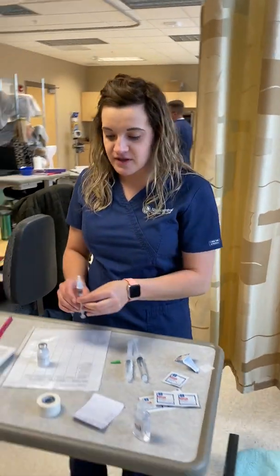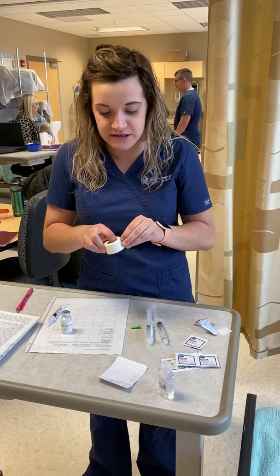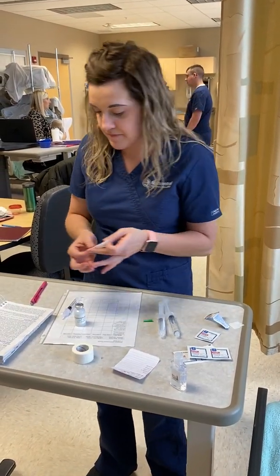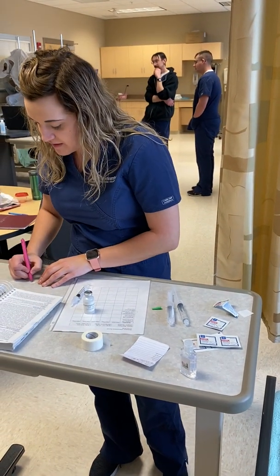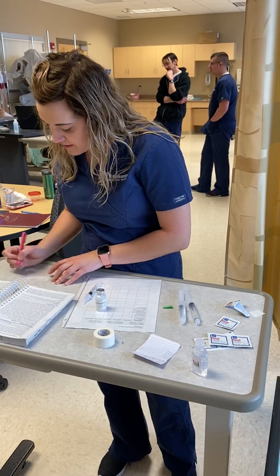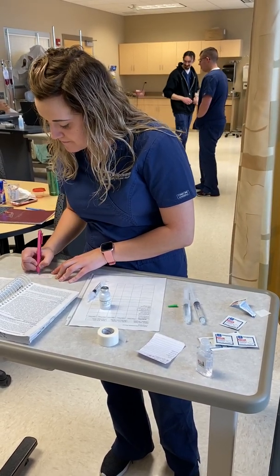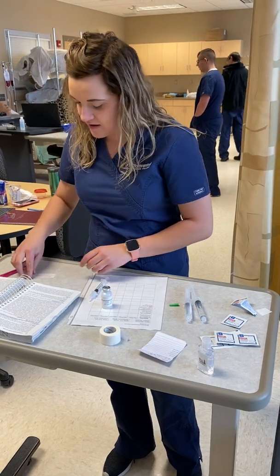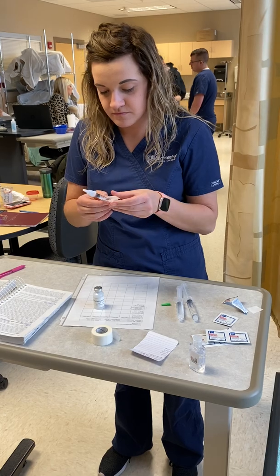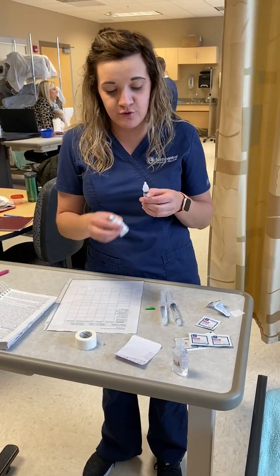Okay, so what I'm going to do right away is go ahead and label the syringe before I go into the room. And then some of the other random stuff, in real life you're probably doing it and thinking about it, but as a student, I'm just going to do one of my checks before I go ahead and go into the room.